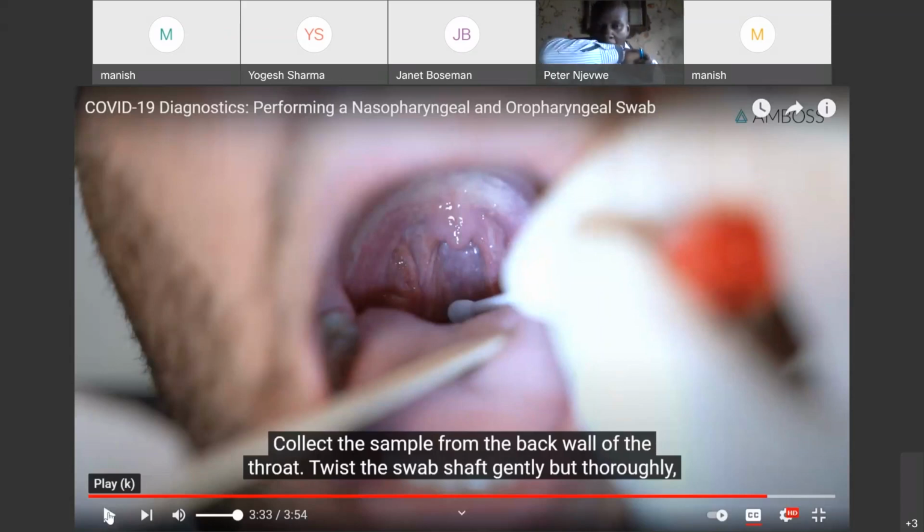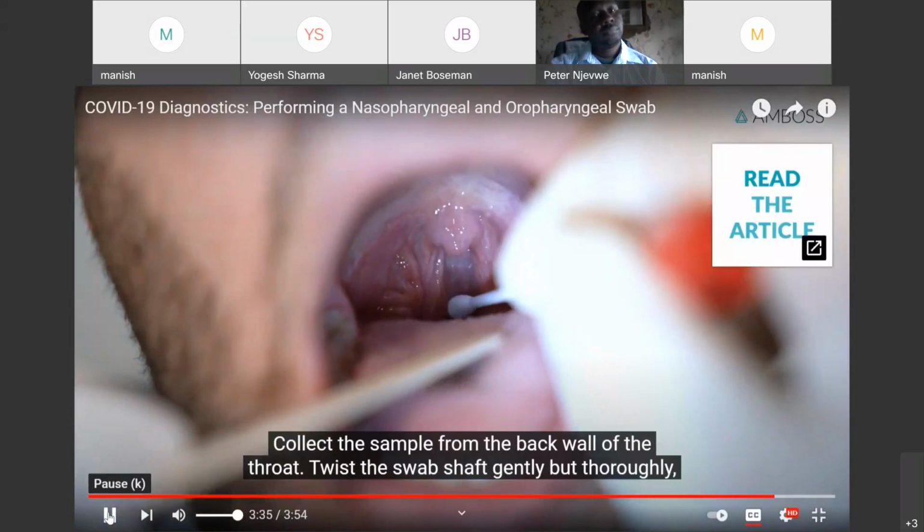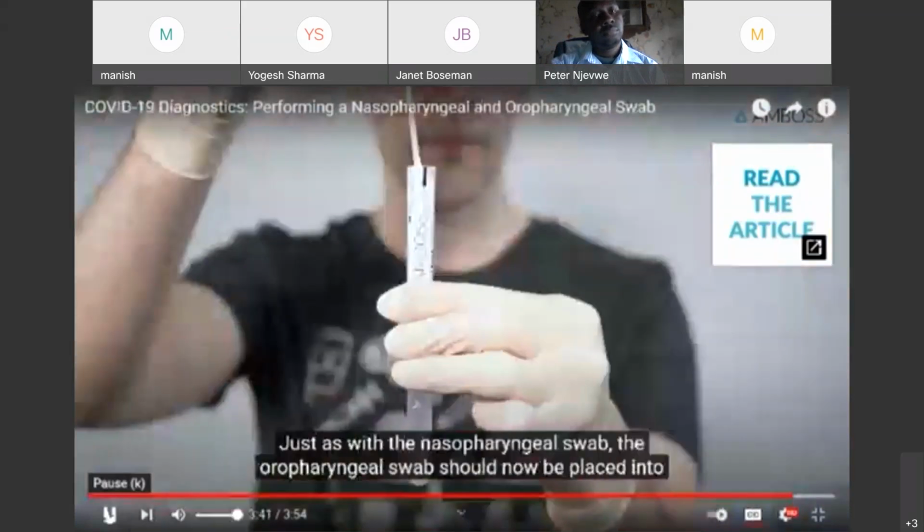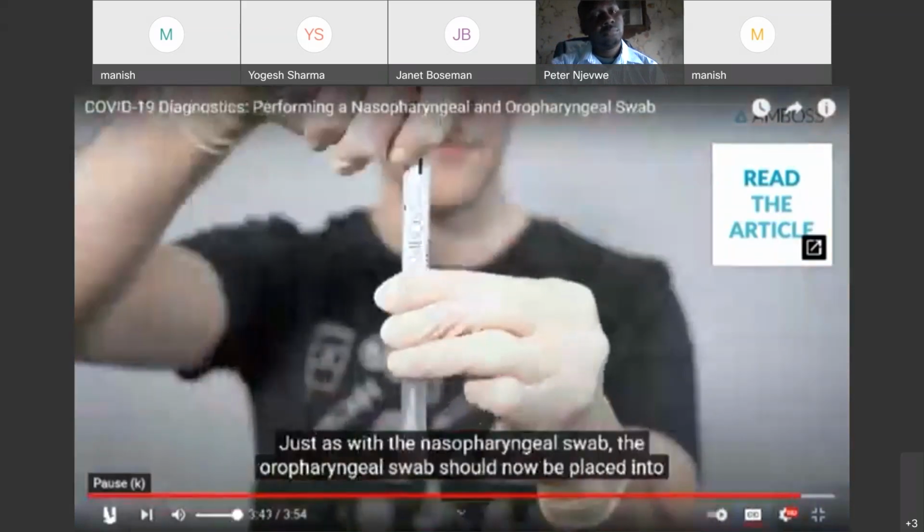If we touch that, the swab may be contaminated with other microorganisms, which can prevent further growth of the virus. So there would be a chance you will get a false negative result. That is why it is advised to take a sample directly from this cavity and not to touch anywhere in the mouth.